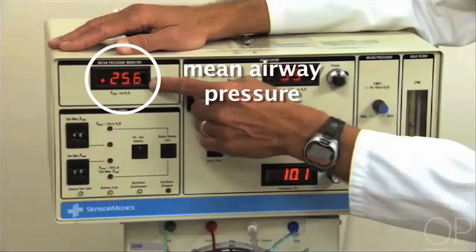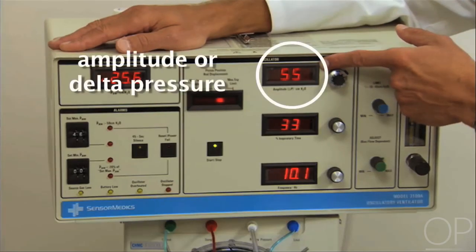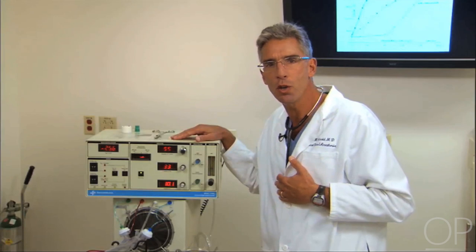This is the mean airway pressure and you're familiar with that number from conventional ventilation and this is the amplitude. This is the delta pressure measured proximally in the ventilator circuit. These are really the only two numbers you need to concern yourself with.